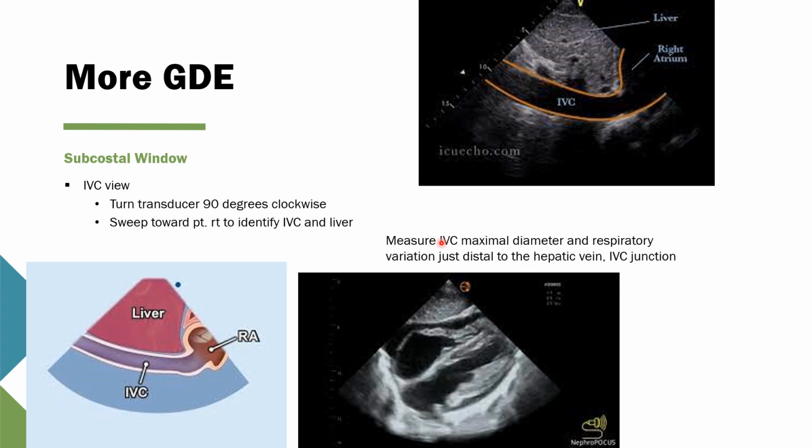Now here is the 4-chamber image in the subcostal view, and it's a good demonstration of what you'll see for a pericardial effusion or tamponade in this region. If this gets more and more significant, it affects the ventricular contractions, and you'll also note those muscular contractive changes in that region.